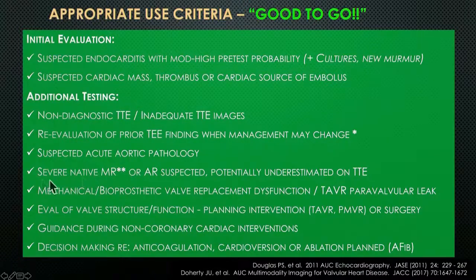Along those lines, assessment of the severity of mitral regurgitation, sometimes just if you're looking for severe, but even looking for moderate to severe, it can be very difficult on a transthoracic echo and may be underestimated. And TEE not only gives you the morphology of MR, but also may help you qualify the severity, although there too, the loading conditions may lead you to underestimate severity as well.